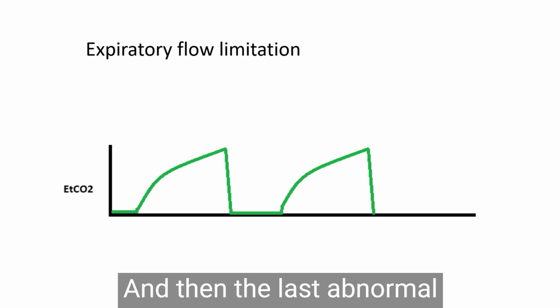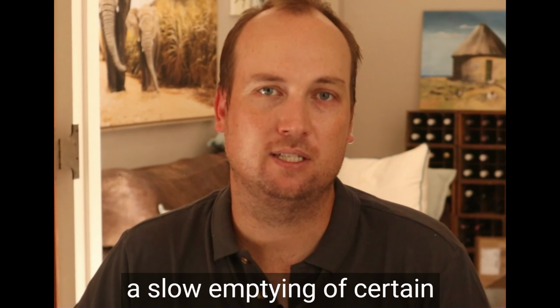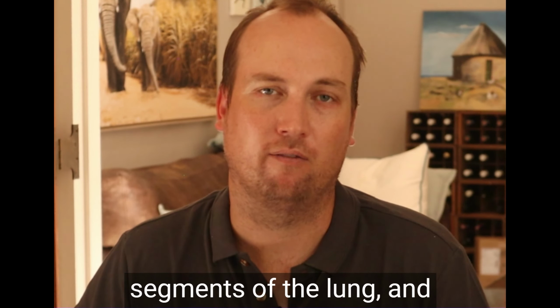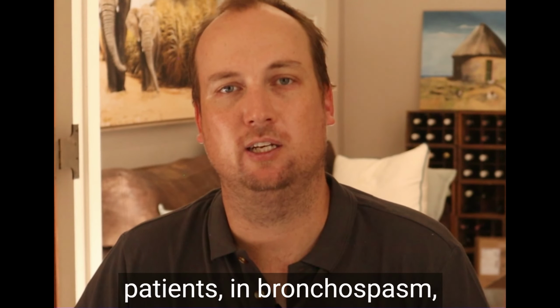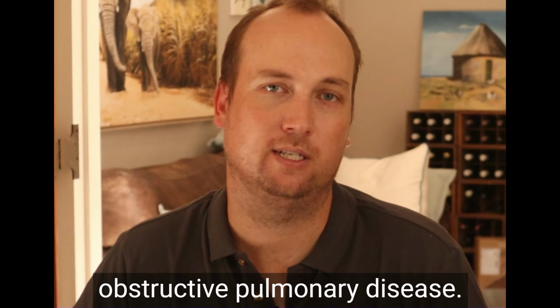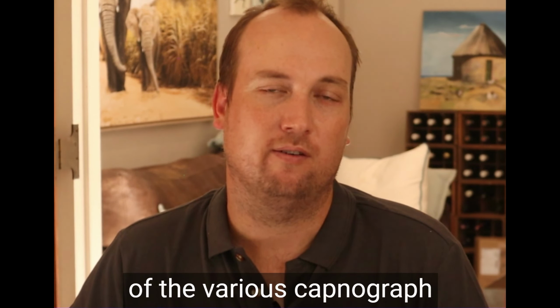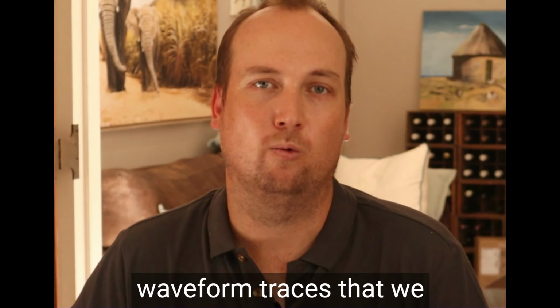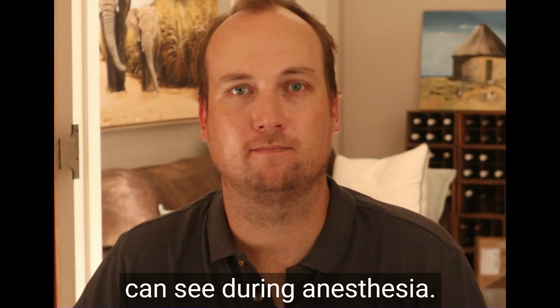And then the last abnormal capnograph waveform is the upsloping waveform of air trapping or a slow emptying of certain segments of the lung, and that is seen in asthmatic patients, in bronchospasm, and in patients with chronic obstructive pulmonary disease. So that is a brief summary of the various capnograph waveform traces that we can see during anesthesia.